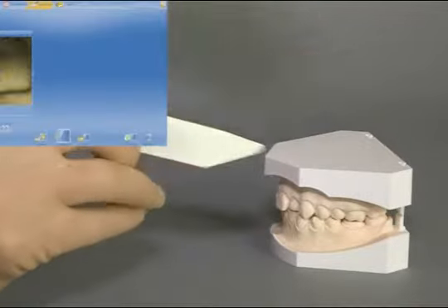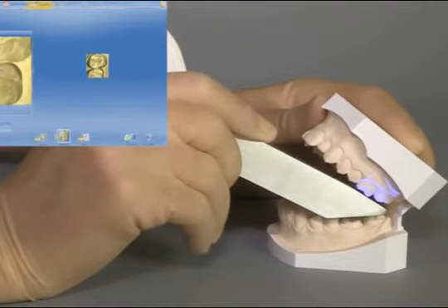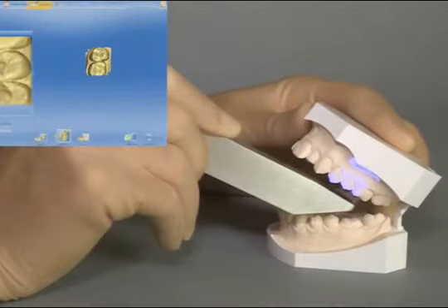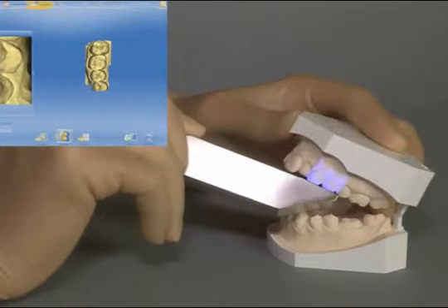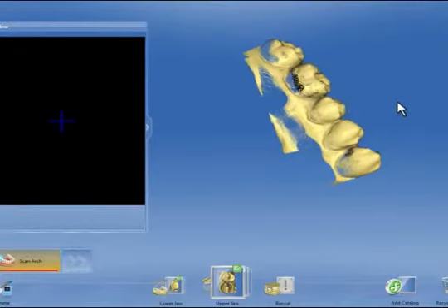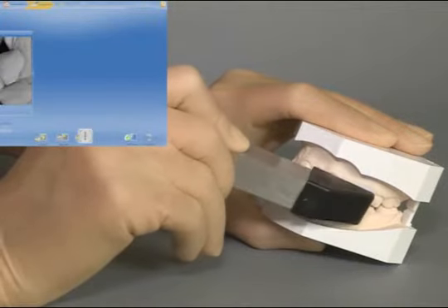Sometimes with real intraoral scans in the dorsal part of the mouth, it is advisable to remove the support from the camera to allow better maneuverability. On the upper jaw, we also begin scanning distally with overlapping exposures towards mesial. In the premolar area, we again tilt the camera slightly towards buccal to achieve good facial surfaces for easier matching of the buccal bite later on. We check this and then change to buccal bite acquisition.